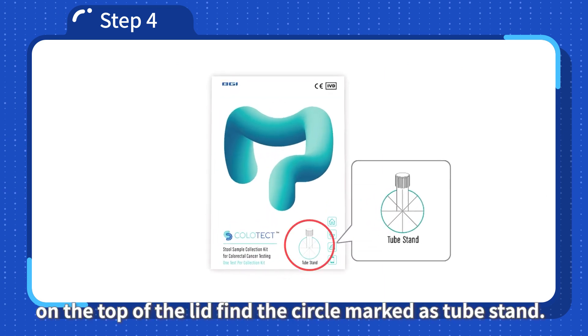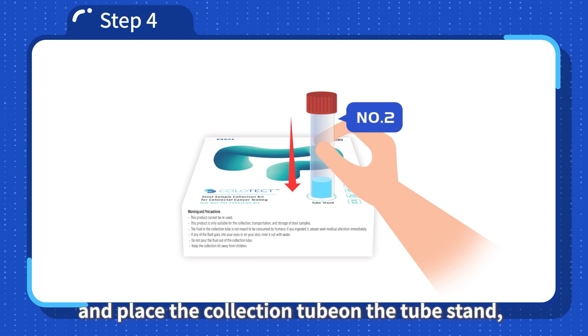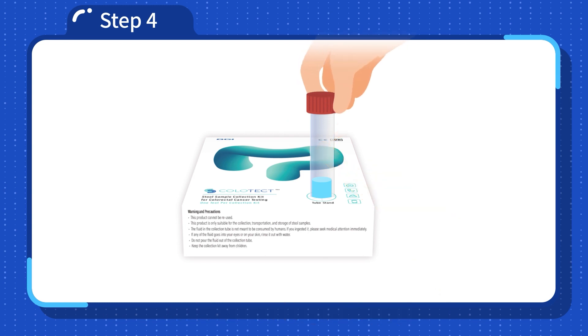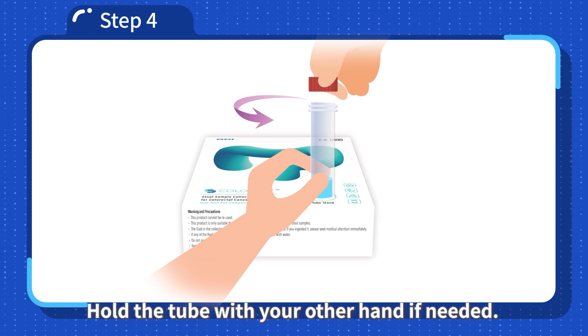Step 4: Place collection tube number 2 on the tube stand. Close the sample collection kit on the top of the lid and find the circle marked as tube stand. Take collection tube number 2 and puncture a hole in the middle of the circle, then place the collection tube on the tube stand with the red cap facing up. Open the tube by turning the red colored cap counterclockwise, holding the tube with your other hand if needed.